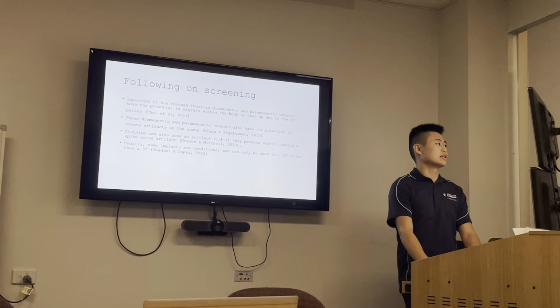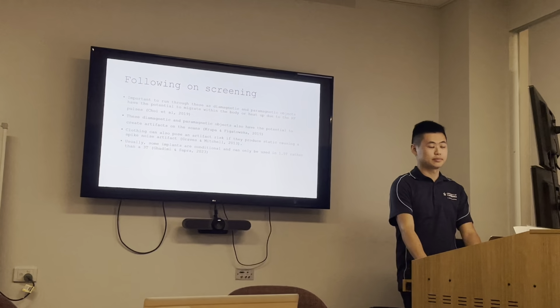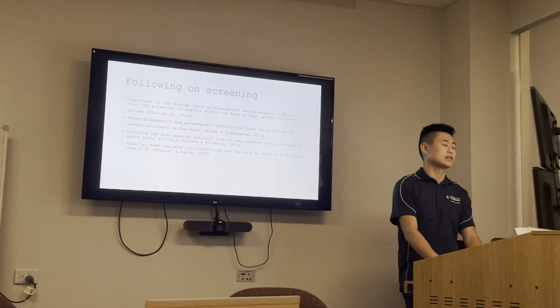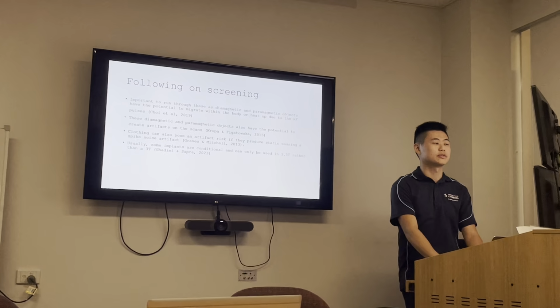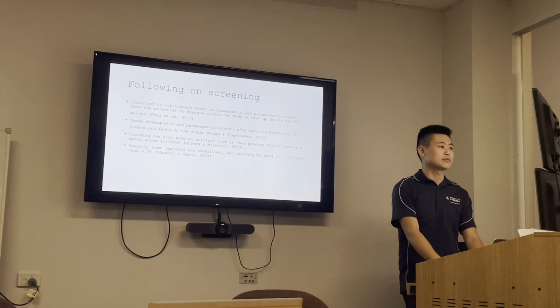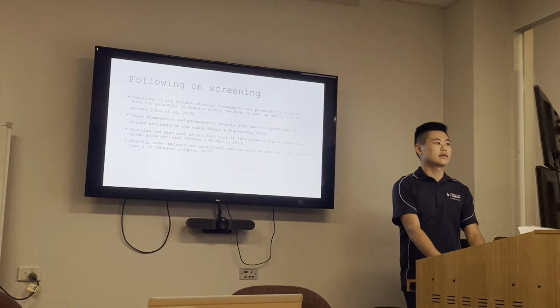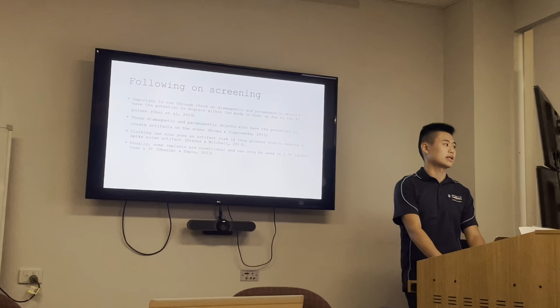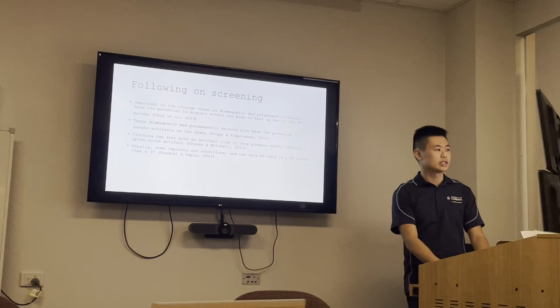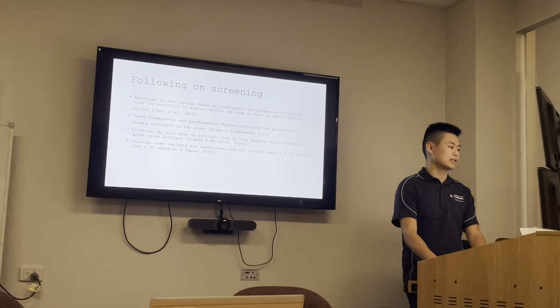So following on from screening, it's important to run through a check on the patient, as diamagnetic and paramagnetic objects have the potential to migrate within the body or heat up due to RF pulses. These diamagnetic and paramagnetic objects also have the potential to create artifacts on the scans. Clothing can also pose an artifact risk if it produces static, causing a spike noise artifact. Usually some implants are conditional and can be used only in the 1.5T scanner rather than the 3T.